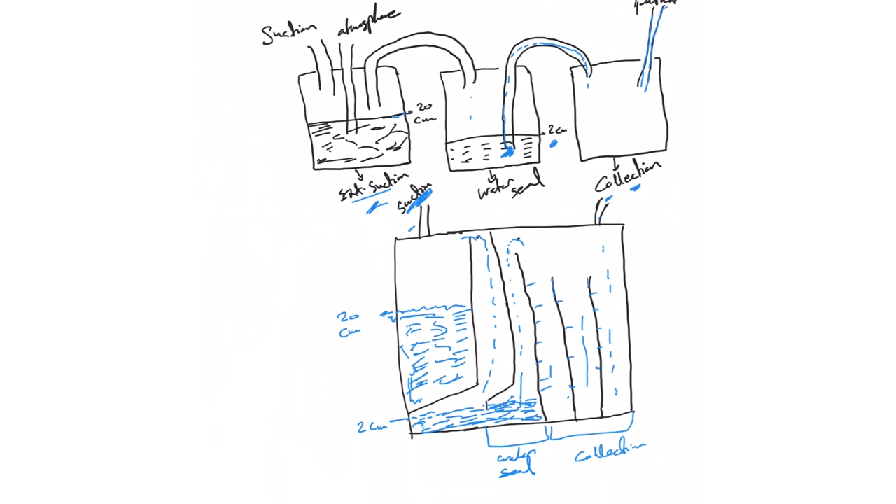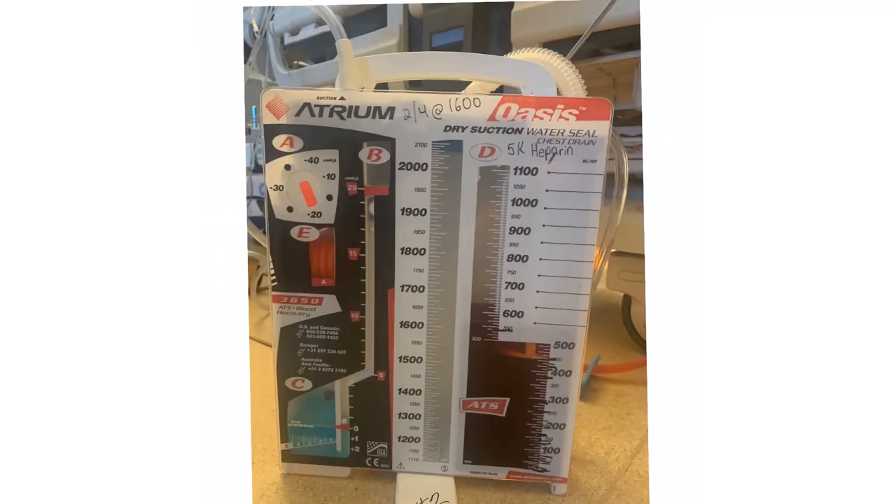We combine all of this in one chamber. You've probably seen this in the hospital — this is exactly a three-chamber system included in one single drainage system. This is the collection chamber. You can see the numbers: 100 ml, 200 ml, 300 ml. Nurses mark it — they don't empty it, they mark the time and volume so they can measure daily output instead of total output. When this fills, air will come into the water seal.